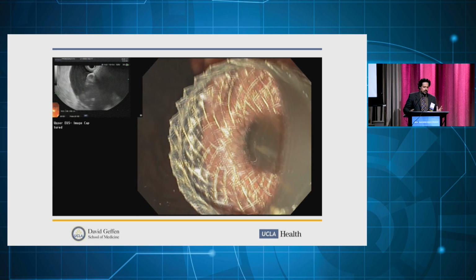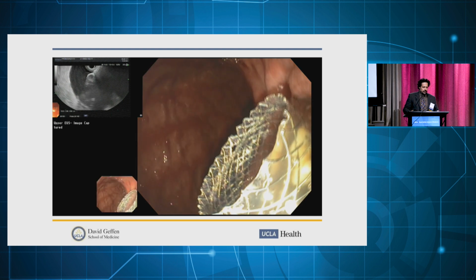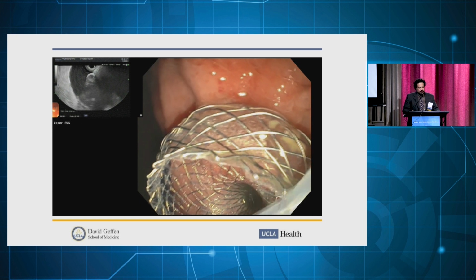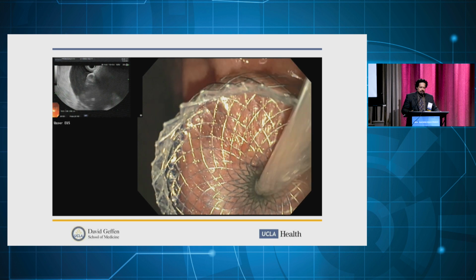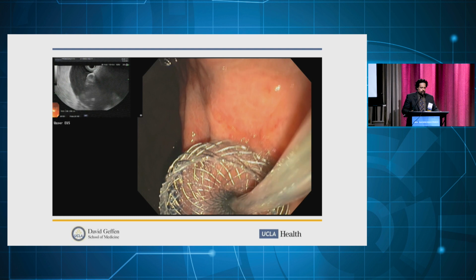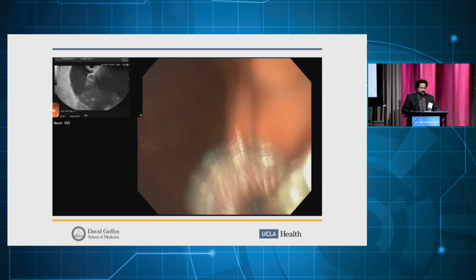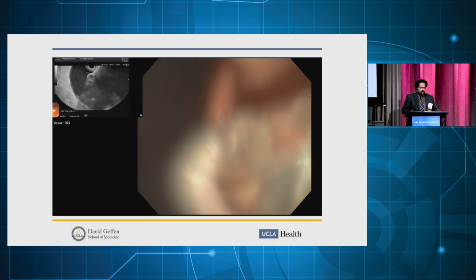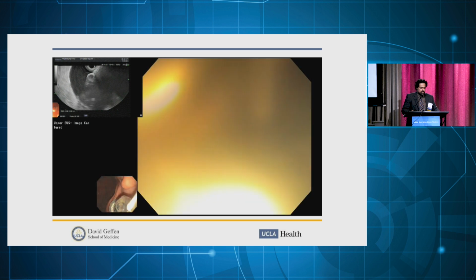You can see relatively quickly, you get a controlled hole in the stomach with lumen apposition and immediate drainage, which is very satisfying. And what you do after that point is kind of dealer's choice: dilate the tract, don't dilate the tract, go in there and start digging around, etc. In this case, we're electing to dilate, and so you'll see that stent lumen open to its maximum, and that allows you to peek inside.